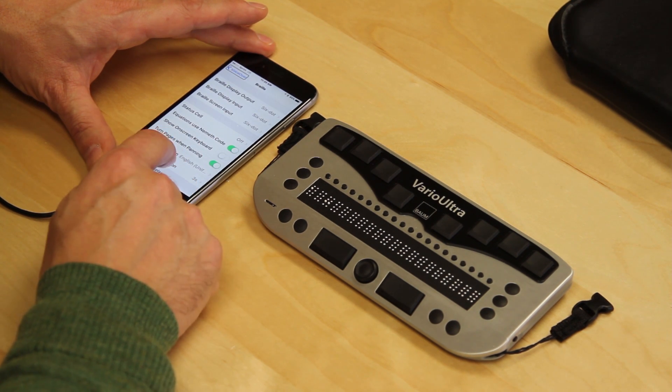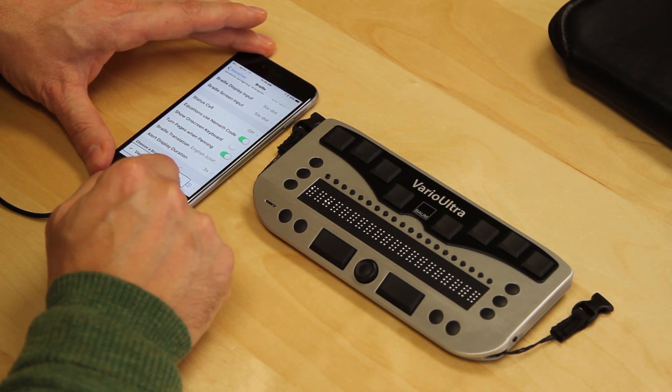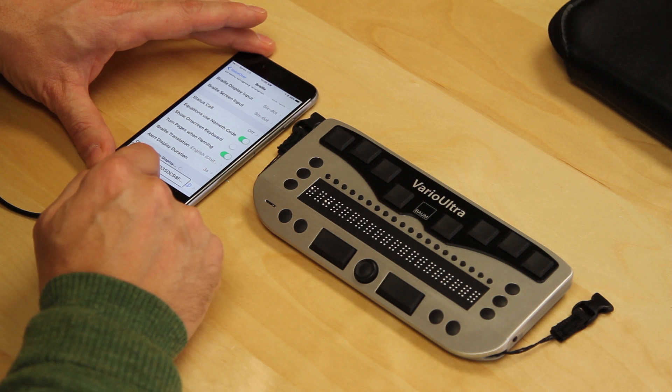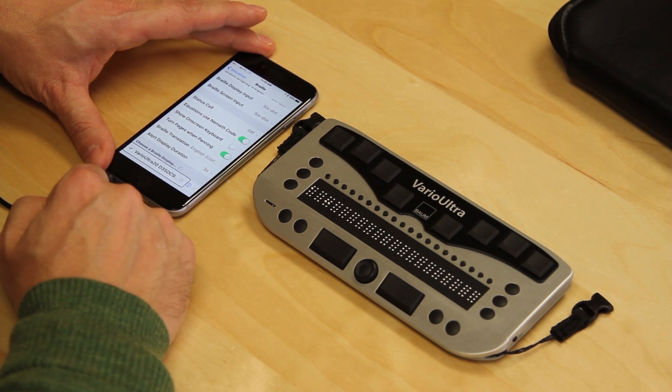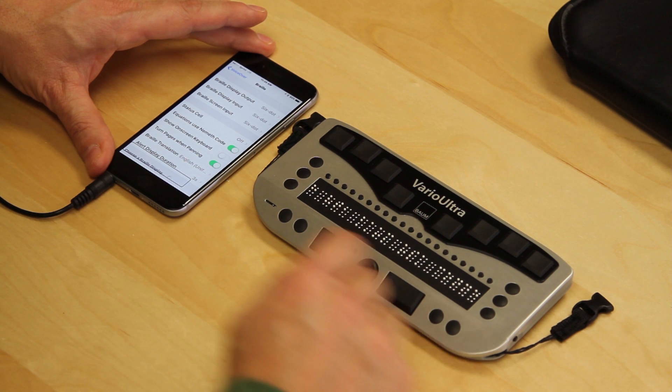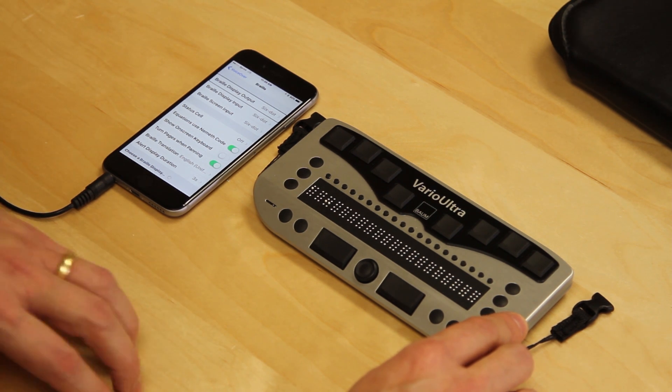I double tap into VoiceOver Braille settings. It shows Choose a Braille device in progress. I see Vario Ultra 20 listed as not connected — that's our Vario Ultra. I double tap to select it and it shows connecting. The Vario Ultra and the phone at this point are now connected.